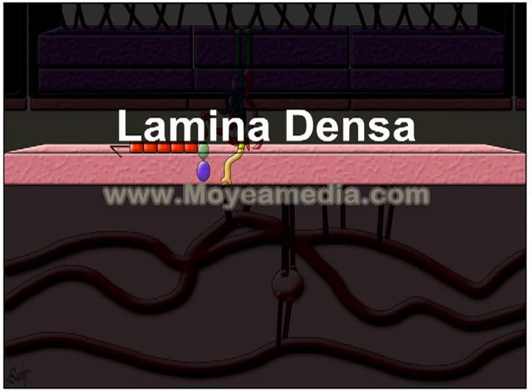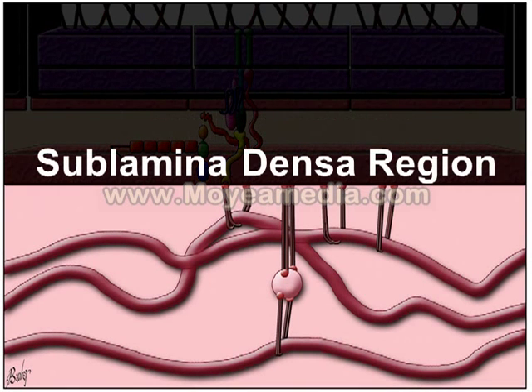Below that, the lamina densa, visible as a dense line in electron microscopy. And then the components within the sublamina densa region. These become especially important in immunobullous disease because we define the diseases and know how to treat the patients and what the prognosis will be based on where the immunoreactants deposit.